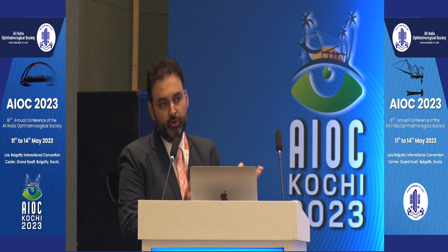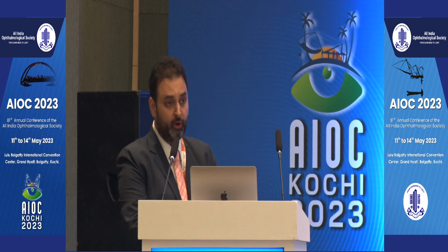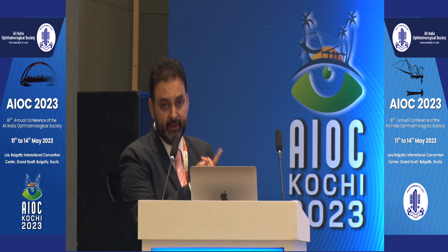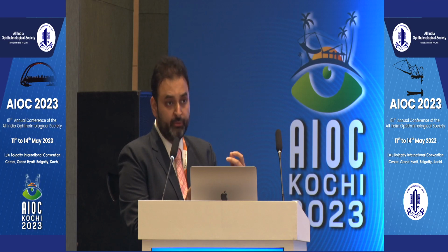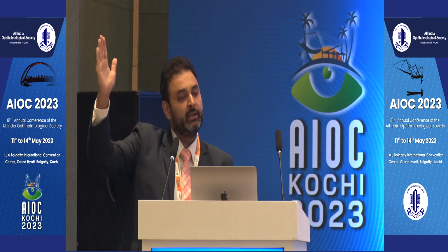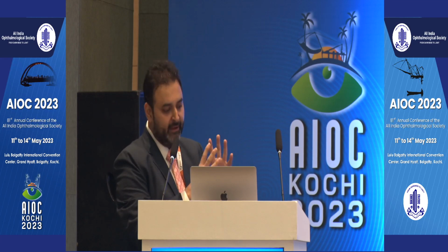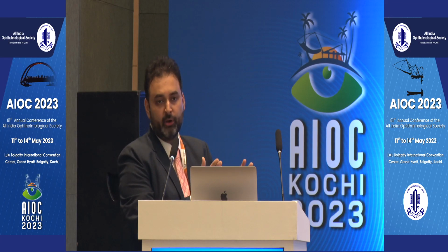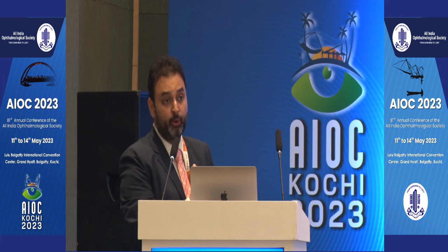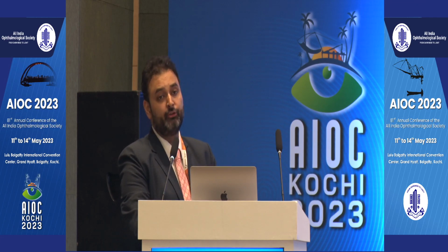One of the good ways of getting it, especially in long myopic or bigger eyes, is to use a 25 gauge flute with the soft tip removed, and jack up the extrusion absolutely to the maximum. You can even get out 5,000 centistoke silicone oil from under the retina. We have done that for a couple of patients who had oil put elsewhere and had 5,000 centistoke oil under the retina.